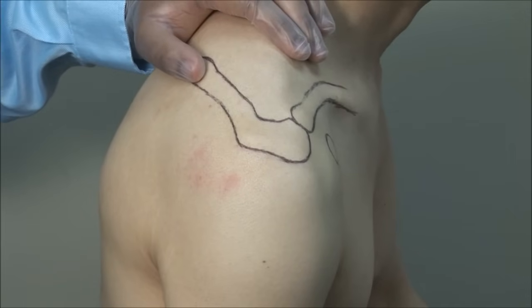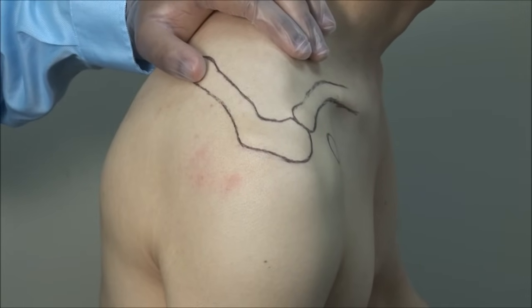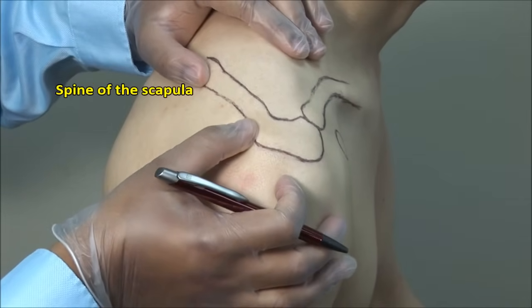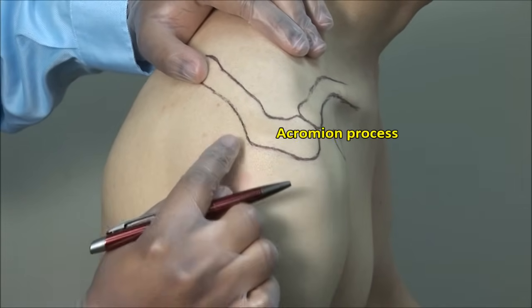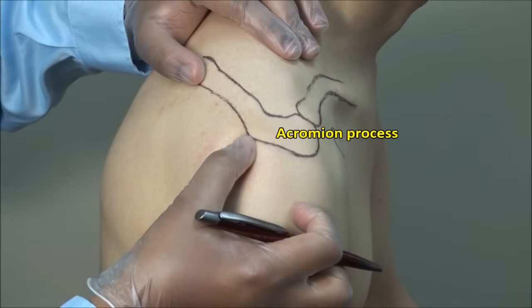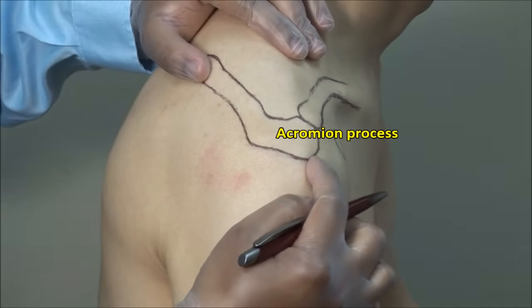There are a few key landmarks when injecting the shoulder. Locate the spine of the scapula — this becomes the acromion process laterally. Identify the posterior corner and the anterior corner of the acromion.